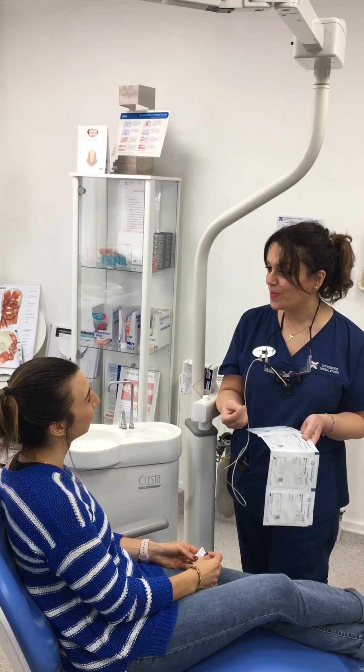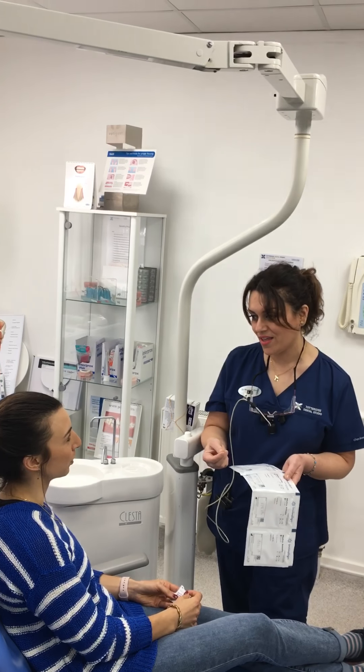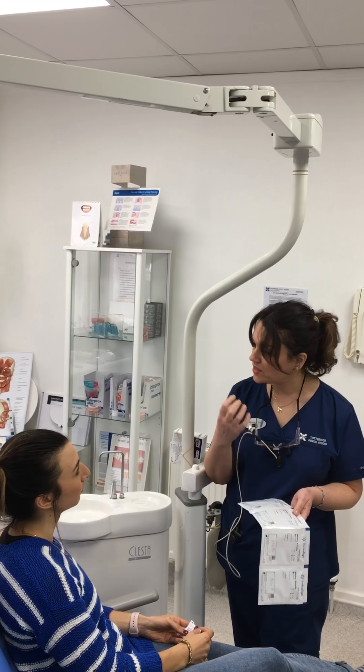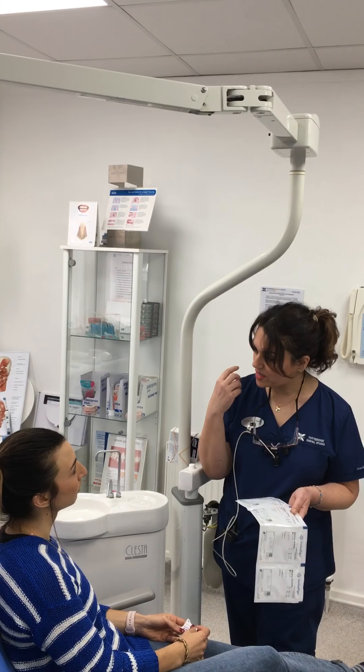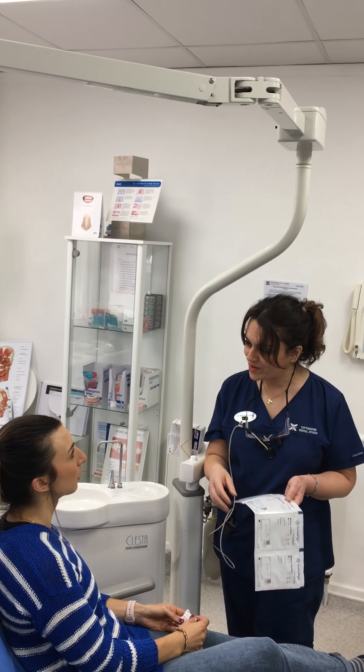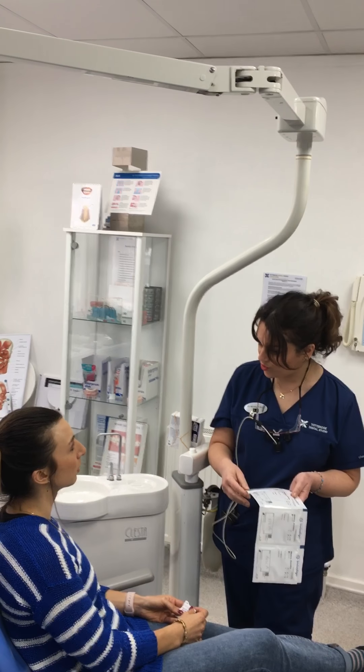Initially when you put them in, they're going to feel a bit tight because you've got the attachments on there. But don't be worried — even if they come off the attachments, I will put them back on for you, because I'm going to see you more regularly initially, just to make sure you're okay.